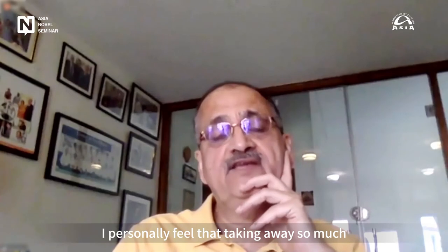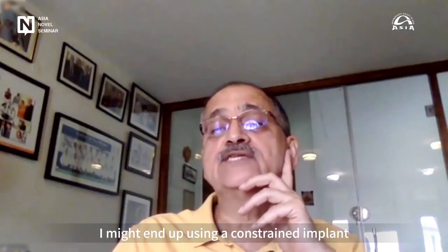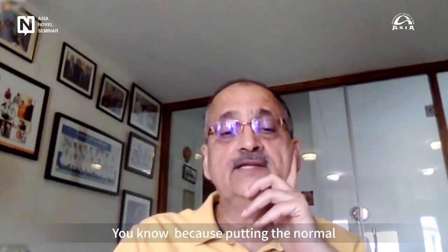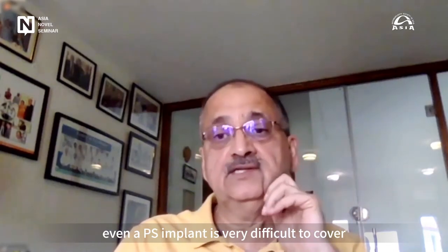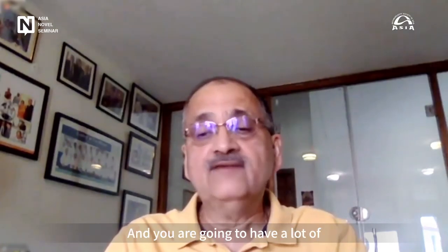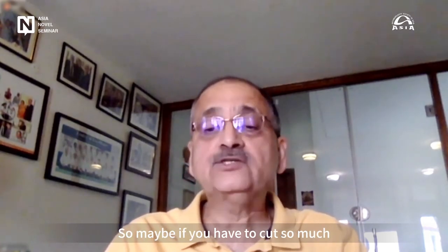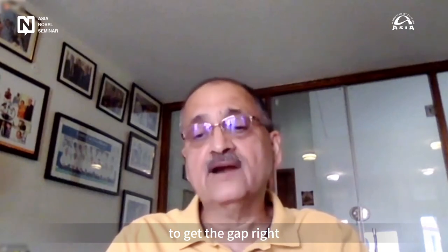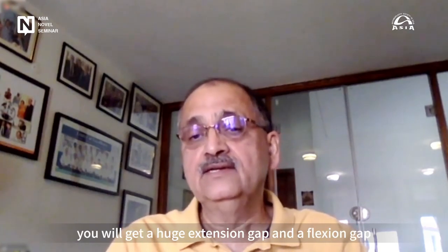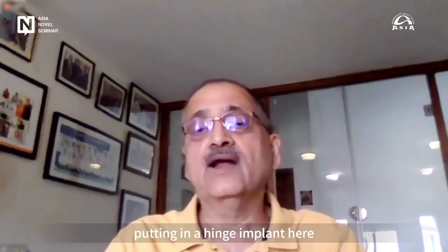I personally feel that taking away so much, probably in my hands, I might end up using a constrained implant. Because even with a PS implant, it is very difficult to cover so much on both sides. And you're going to have a floppy, unstable situation. So if you have to cut so much to get the gap right, you will get a huge extension gap and a flexion gap. You might have to consider putting in a hinged implant here.